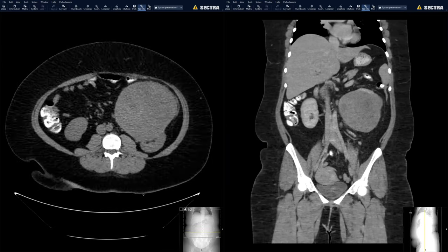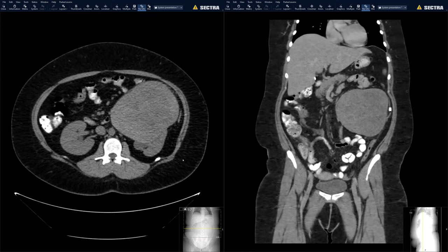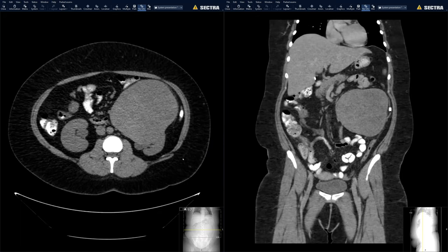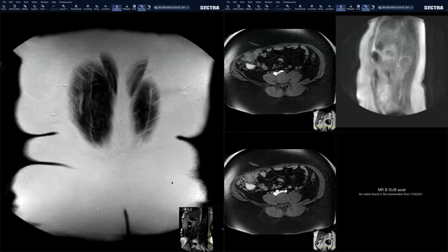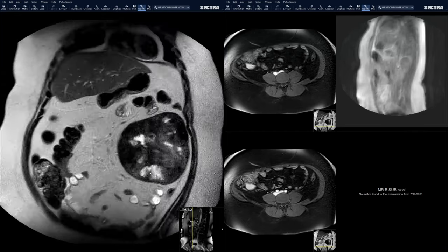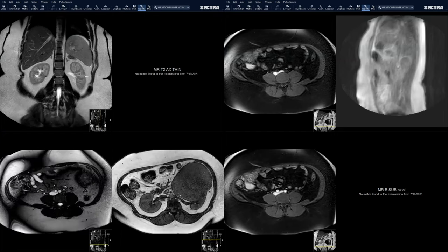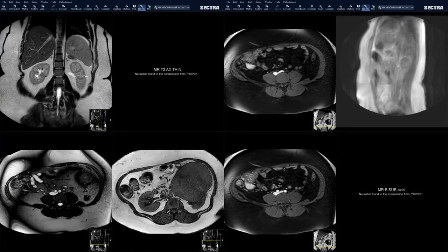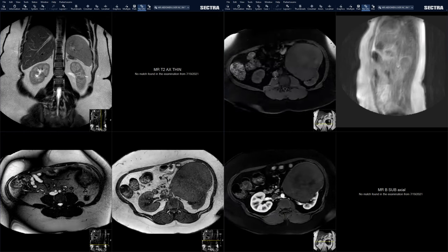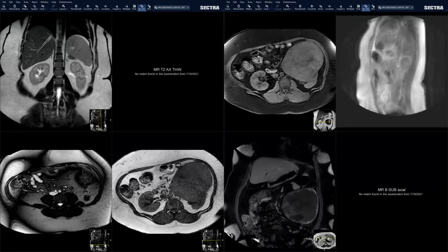It looks like a really large mass with enhancing components, and it's affiliated with the hilum. It's reminding me of a MEST tumor. I don't have the final diagnosis yet, but we will have it maybe in the next couple of weeks. So I'm going to show the MR now. It has a really T2 dark component. So it's almost like a fibrous kind of tumor. That's basically what I thought, that it's probably a fibrous tumor, but then the problem is it really doesn't enhance that much. It does enhance in the periphery.